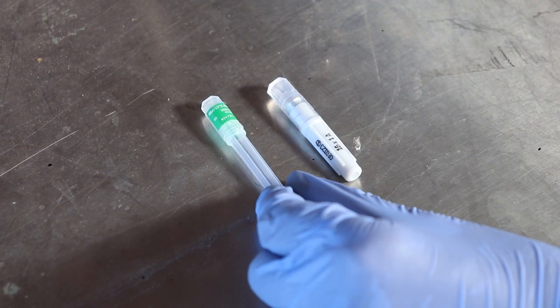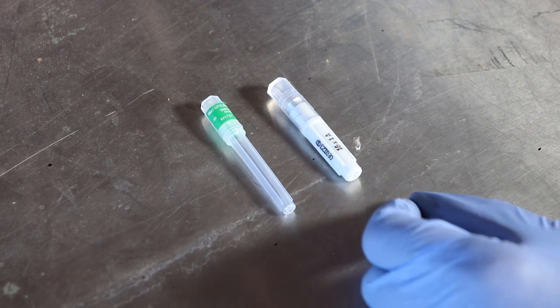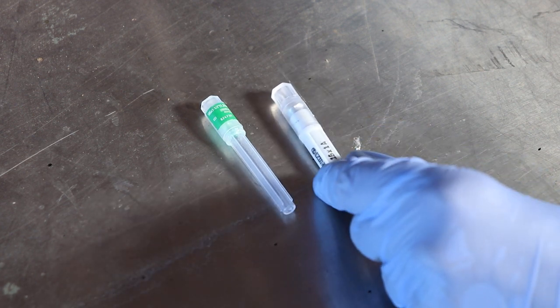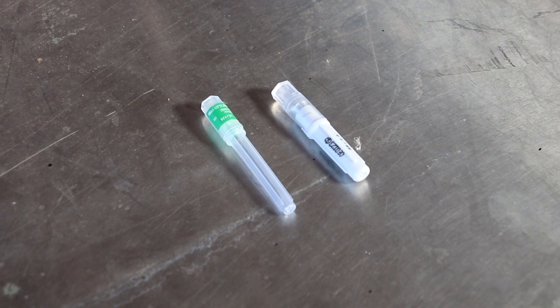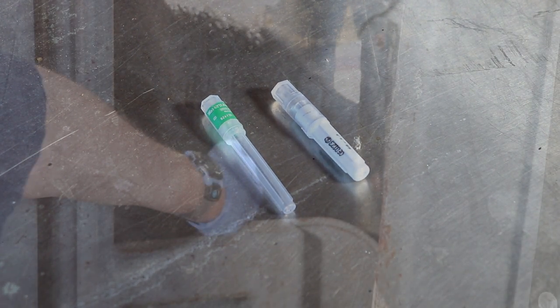Pick a needle gauge that will allow you to give the drug without using too much pressure — typically either a 16 or 18 gauge. For a subcutaneous injection, use needles up to one inch in length.